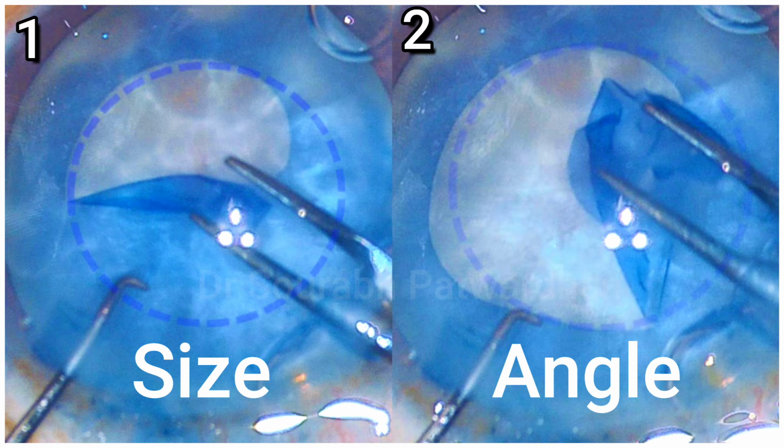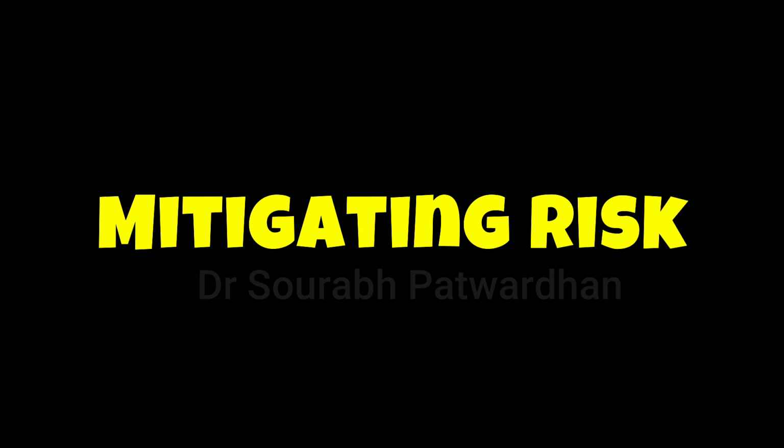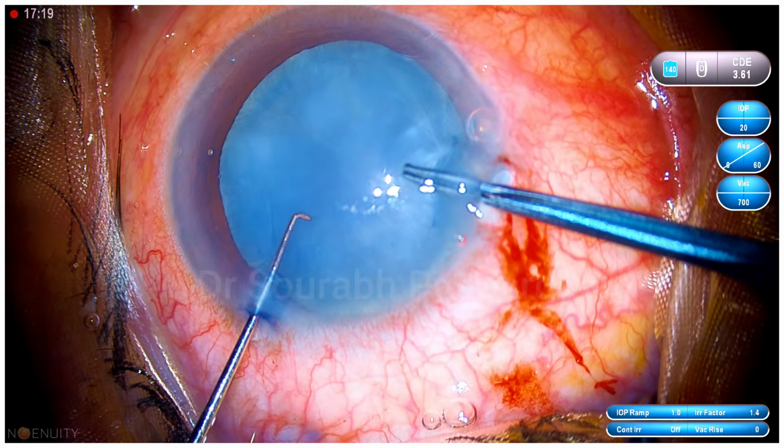It's also, if you see the angle, it's going outwards a bit, and this is where the surgeon fails to correct the course of the capsulorhexis. So both the things have to be always analyzed on the go when we are doing capsulorhexis. And this is not only for the intumescent cataract; it is for all types of cataracts here.